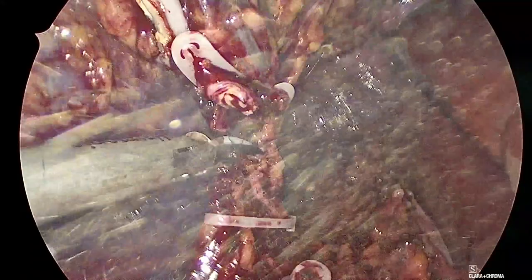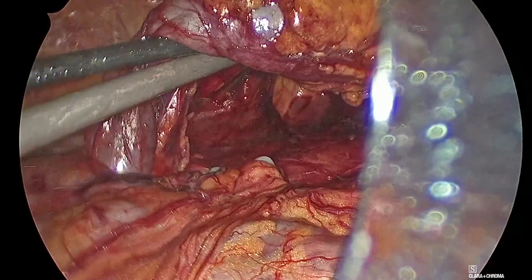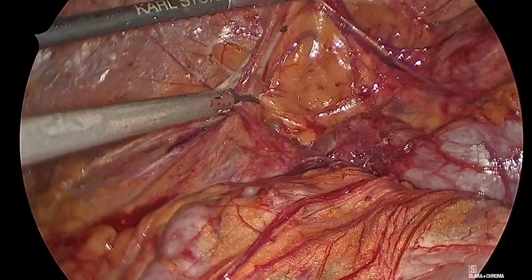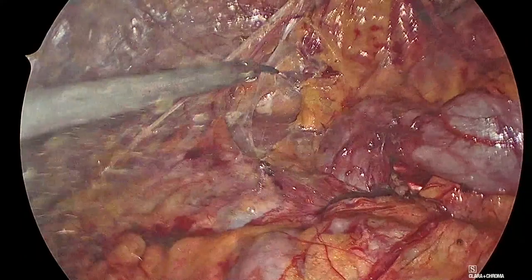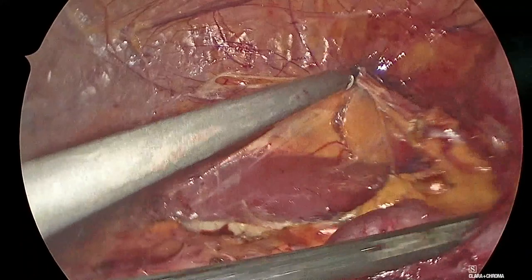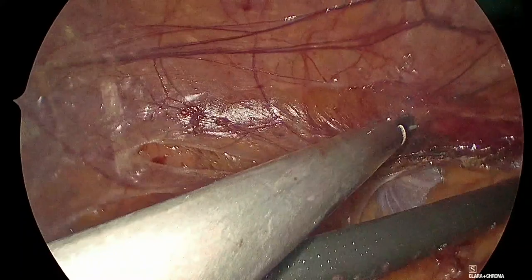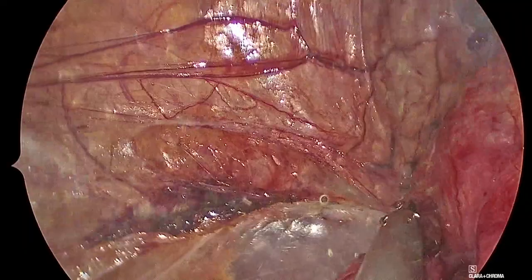All right, so this part is done. So move back, vamos abajo. Let's see if we can clean the image a little bit. So now the next question is, how far do we want to go with the ureter dissection? Because if we're going to do it open, normally what I do, I go right to the iliac vessels, and then I stop the nephroureterectomy and I open. Okay, so now we go lateral. Luis, ¿me puedes poner central?